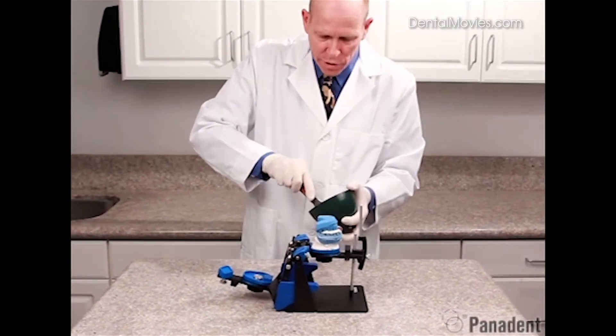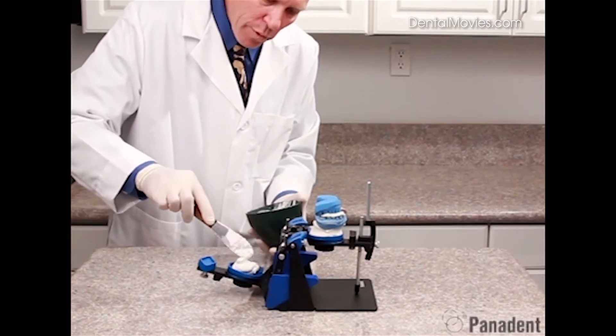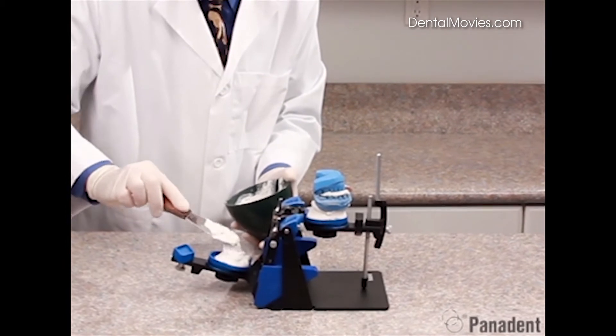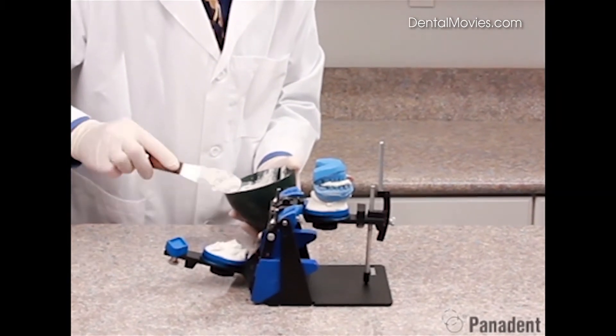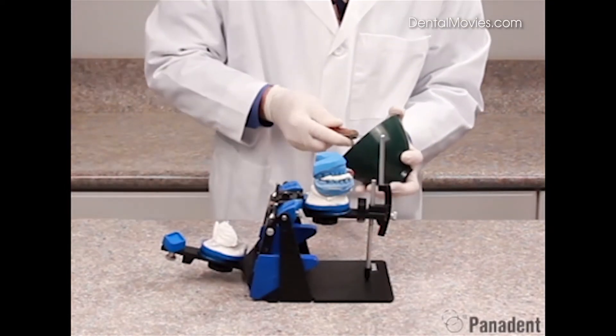We've mixed the plaster, and we first want to add some plaster to our lower mounting plate. Make sure we get it around the center retention lug really well. And we want to go ahead and fill that mounting plate up because we have retention lugs around the lateral edges.